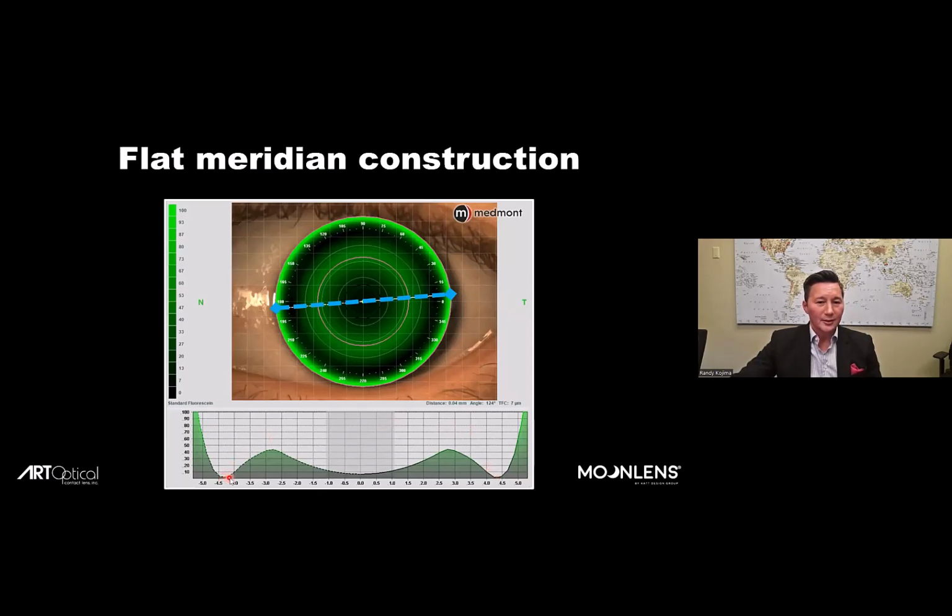And you see that touch down on the eye surface here. So that would be here at 9 o'clock, and then again here at 3 o'clock. Then you have your edge lift that we would always want in any kind of corneal rigid lens. But then interior of the landing and edge lift is your tear reservoir. And this is what creates our orthokeratology effect. So thin in the center, thick on the outside, creating the hydraulic force that manipulates eye shape.